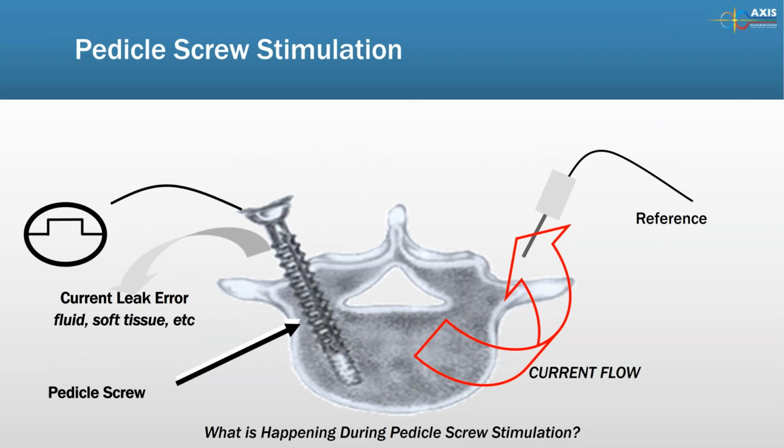A micro breach is a very small breach which opens only when you put the screw in. If you take out the screw, the breach will be gone. So if you stimulate the hole with a probe, the threshold will be very, very high. But when you put the screw back, the threshold will be low. That's a typical characteristic of a patient having a micro breach.